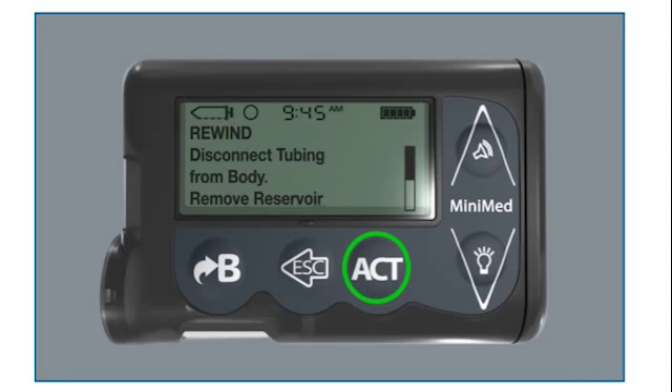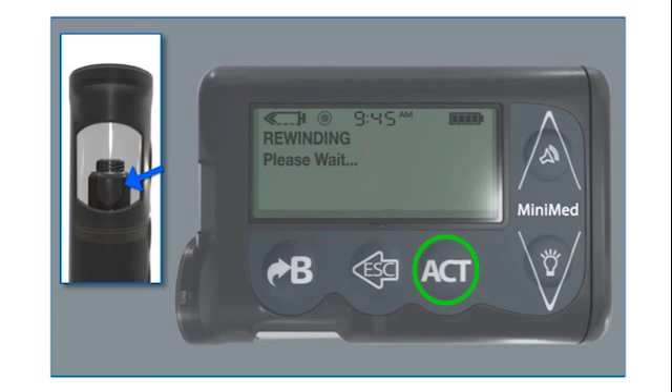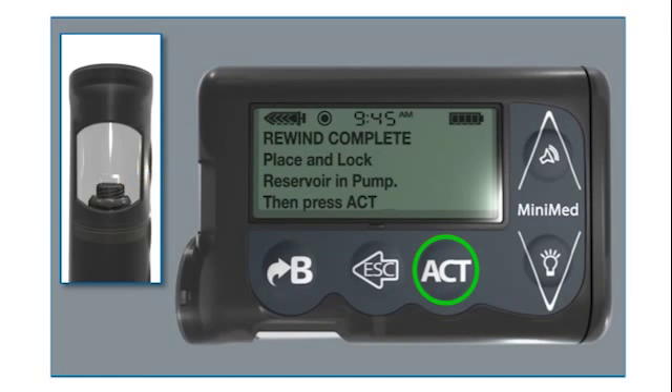The rewind screen will appear. Press the down arrow twice to see the rest of this message. Press Act and the rewinding screen will appear while the piston rewinds. Rewind Complete appears when the piston is rewound.